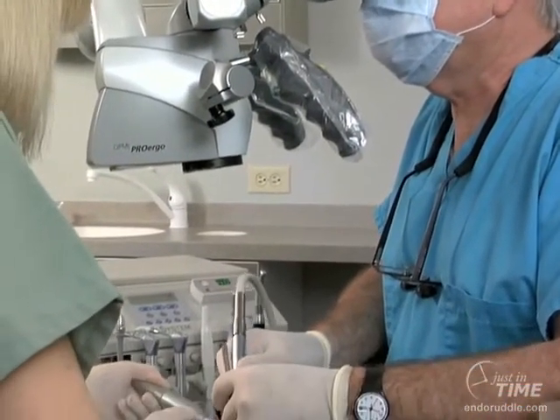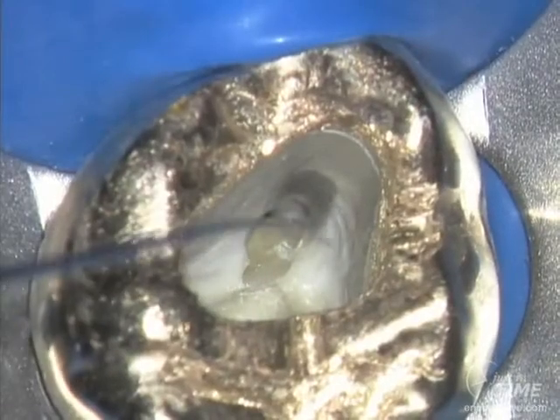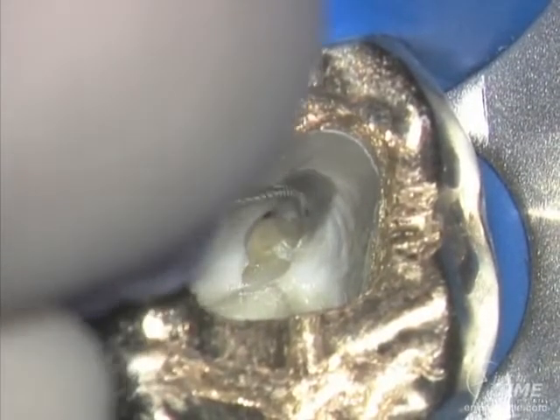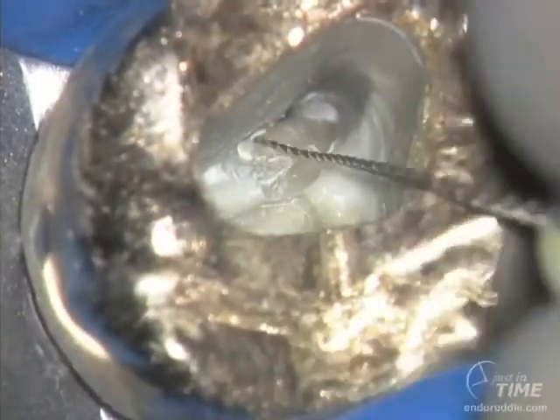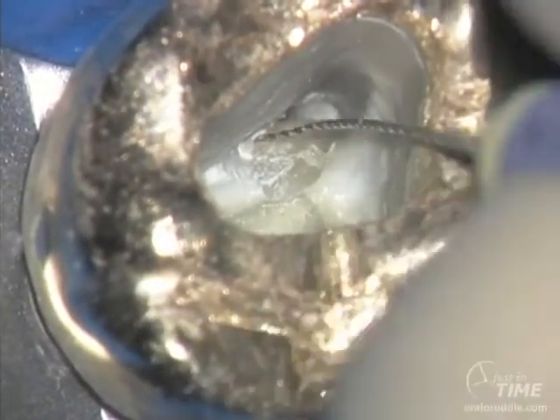We can progressively expand the coronal part of the canals to remove restrictive dentin, so hand files stand up straight and tall. This is a very, very tight, calcific MB2 orifice.